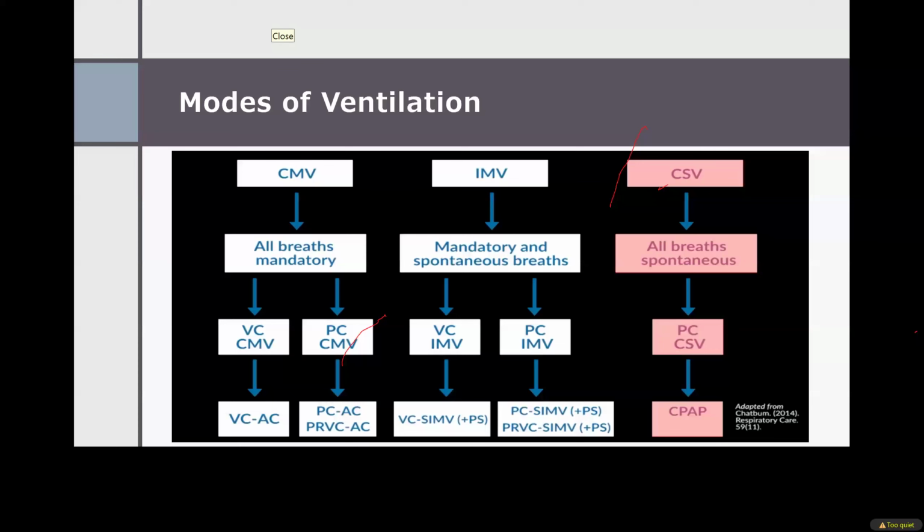But the main thing is that what you're trying to do is to tell the ventilator, is it going to give whatever you're providing based on pressure as the main parameter or volume as the main parameter? And by volume, I mean tidal volume. Most ventilators and most NICUs use pressure control. So basically, they're just the pressures, and that delivers the ventilation to the baby.